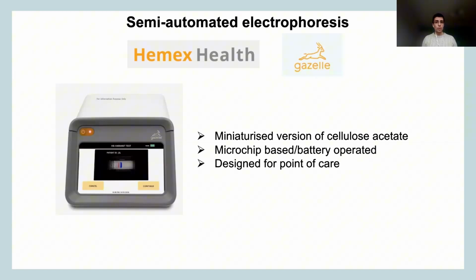And this is an example of an analyzer from Hemex Health called the Gazelle. It's been used in a couple of settings. Thankfully, we were quite fortunate that Hemex Health, in about 2022, if I'm not mistaken, approached us because they wanted to do a little validation with us. So they provided the analyzer and reagents, and we tested the limits of its usage and capabilities. We ran quite a good amount of samples, and I'm going to present the results soon.